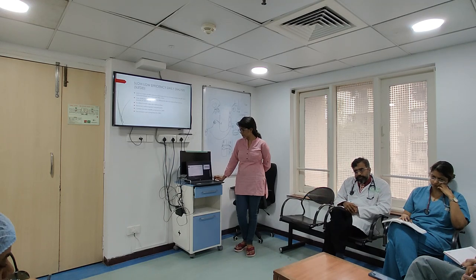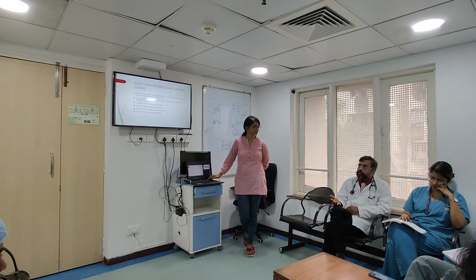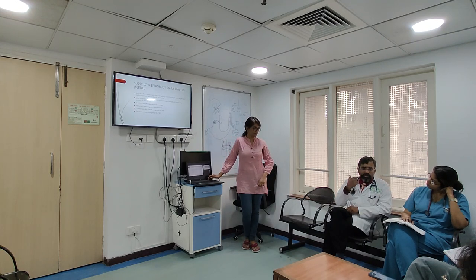Clear? So for a SCUF, I don't need that. So tomorrow if I have a patient who comes in with gross fluid overload and not responding to Lasix, do a SCUF immediately. Put it in the line, do a SCUF.